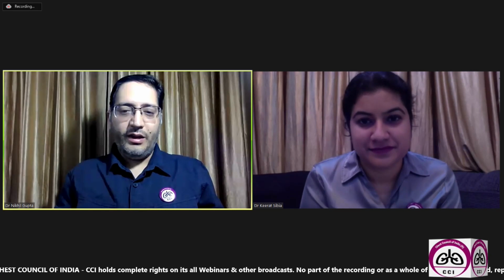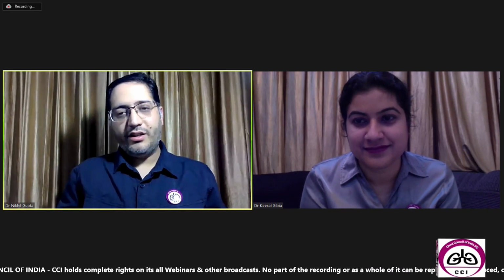This other question is by Dr. Saibal Ghosh from West Bengal, Kolkata. And Dr. Saibal is asking how to pick up interstitial pathology earlier in chest X-ray. So ILD and interstitial pathology and then miliary tuberculosis. Just like a few pointers. In miliary TB, there will be miliary shadows, like very small shadows.